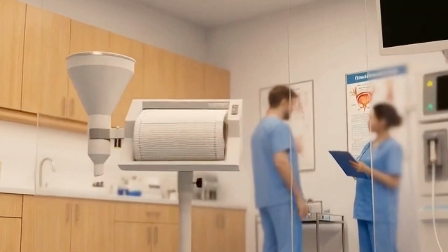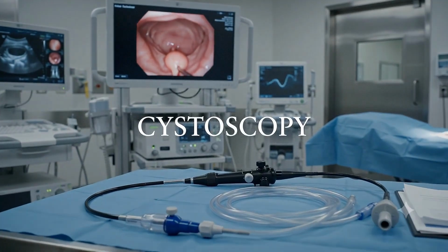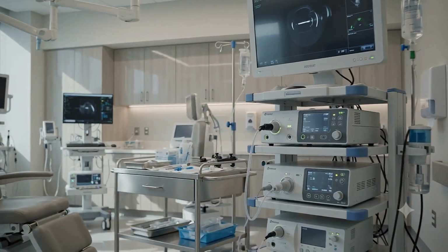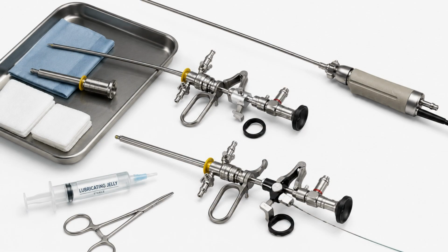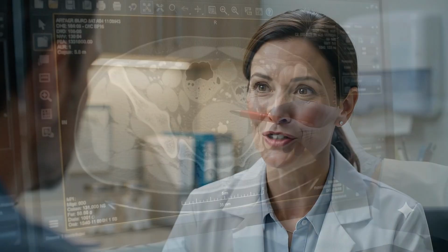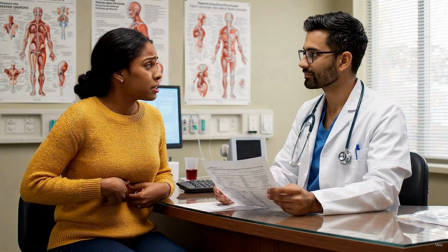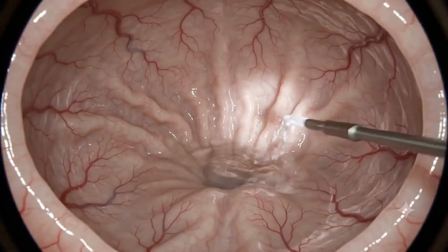Now let's take a closer look at 3 important diagnostic procedures used in urology. Let's begin with cystoscopy. A cystoscopy is a procedure that allows the provider to directly visualize the inside of the urethra and bladder using a thin instrument called a cystoscope. This procedure may be performed to evaluate blood in the urine, recurrent urinary tract infections, bladder stones, urinary obstruction, bladder tumors, or persistent urinary symptoms without a clear cause. Because the provider can directly inspect the bladder lining, cystoscopy remains one of the most valuable diagnostic tools in urology.